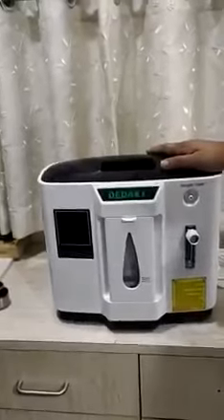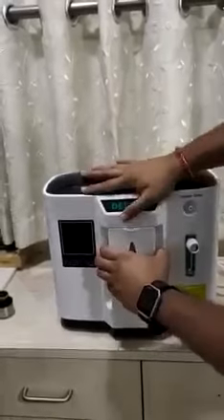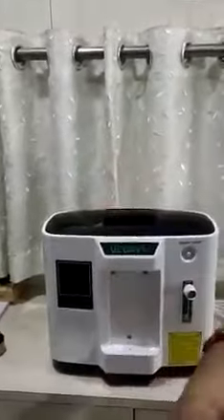This is an oxygen concentrator. I'll show you how to use it. First thing we need to do is fill this tank with water — the water level should not go above this mark. First, fill it from here.